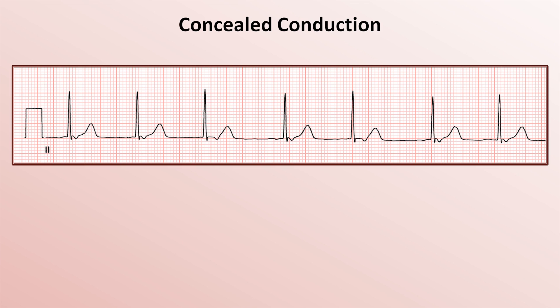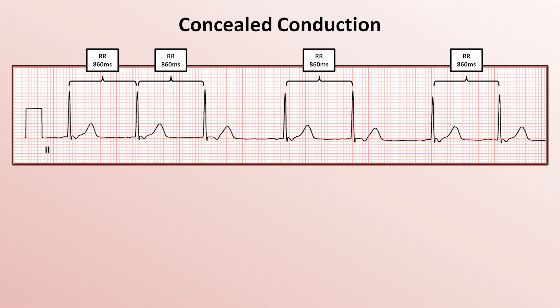First, what underlying rhythm is this patient experiencing? It's narrow complex, with a rate of around 65-70 beats per minute. The QRS complexes are not preceded by a P wave, and if you look carefully, you'll see a subtle retrograde P wave at the beginning of the ST segment immediately after the QRS complex. In the US, this is most commonly referred to as an accelerated junctional rhythm. If you look at this one more carefully, you'll notice something interesting: the rate is not constant. The RR interval is typically 860 milliseconds, except for two intervals which are 1020 milliseconds.